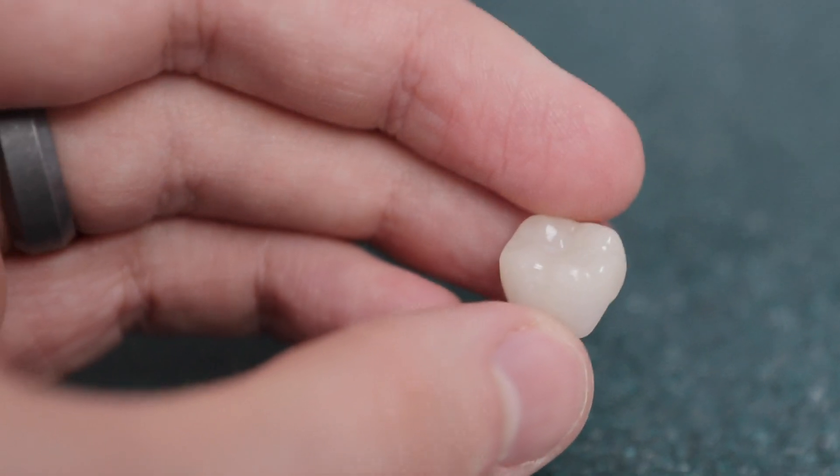We'll get into the technology in a moment and show you everything that's involved. Nick is going first — Dr. Nick is going to be showing us how it's done.